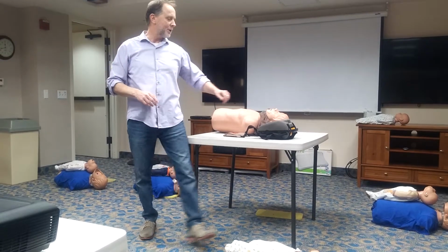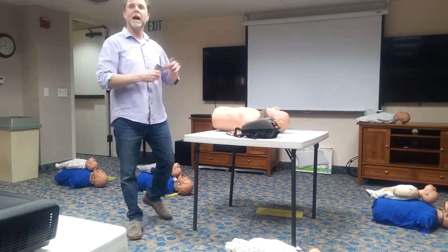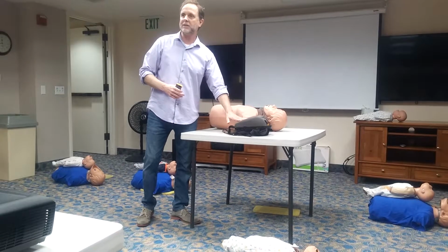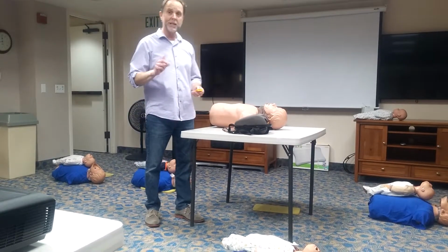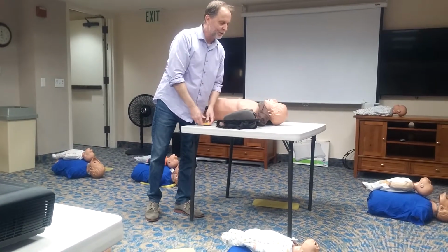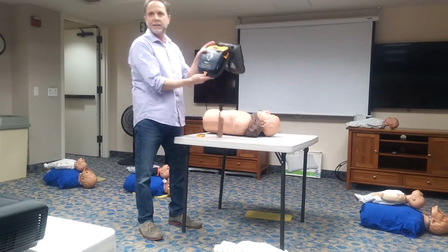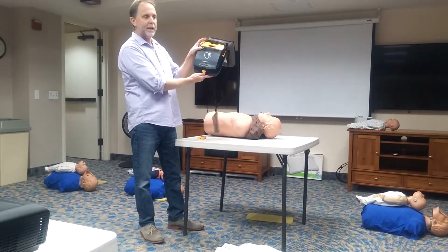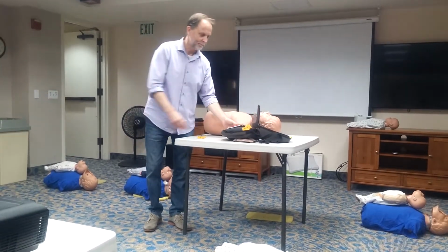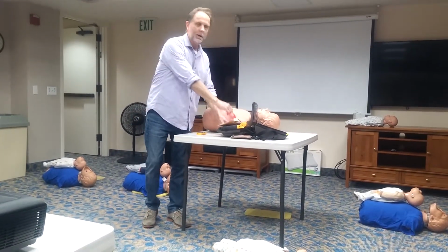Now, ideally, we want to set up the unit on the left-hand side of the victim. So if your partner is doing CPR and you arrive, you've called 911, and you have arrived with the AED, we're going to set it up on the left-hand side of the victim. The first step, remember, was to turn it on. It doesn't matter what brand you're using, they all operate the same. There's an on-off button. So we're going to turn it on. Call for help. Remove all clothing from the patient's chest.